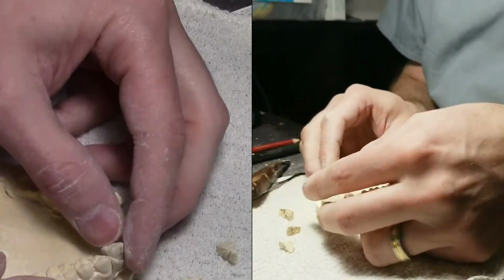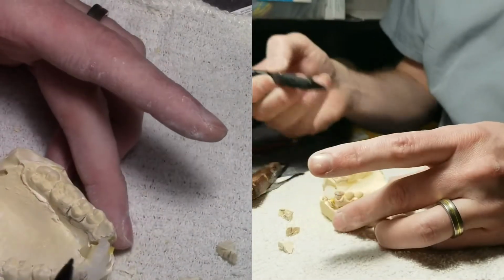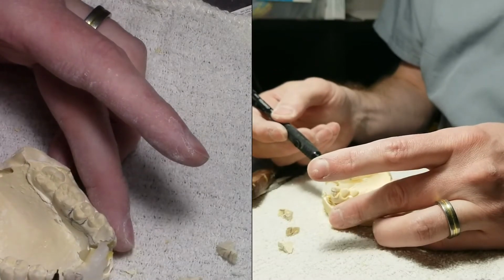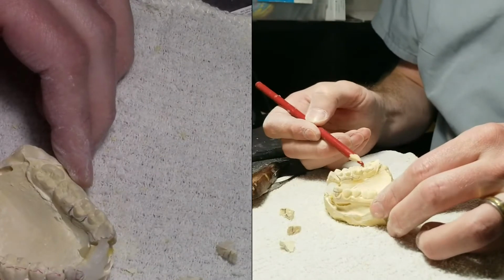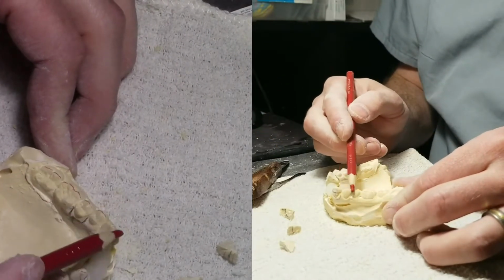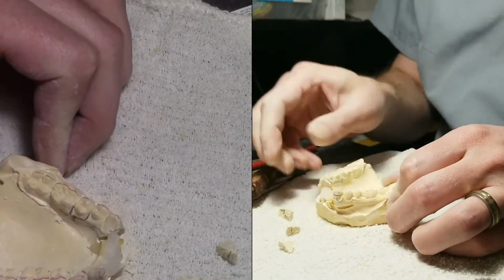I'm just going to stick it in there. Just right, and I'll try to line it up. So you're kind of looking at this. I don't know if I have a good pencil for this. Use this red one so everybody can see it. See this line of cusp tips? I'm going to try to just make a natural ridge here.